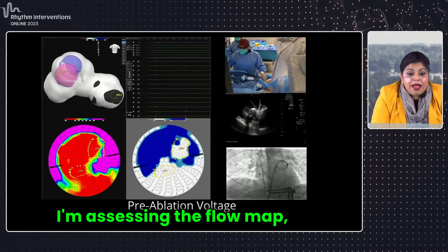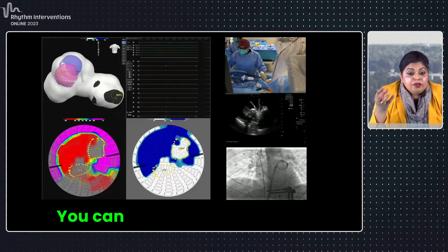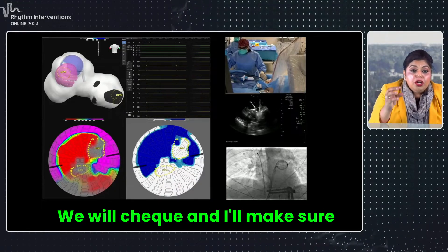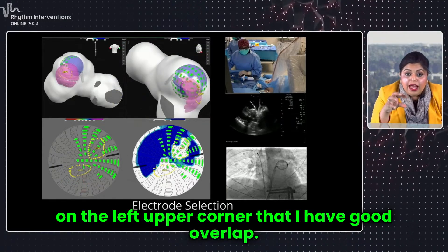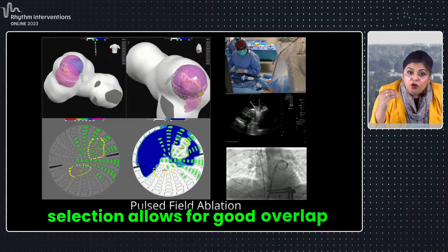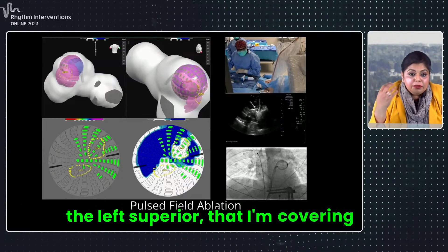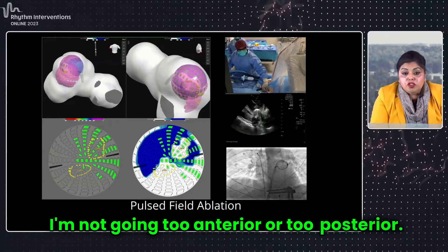I'm assessing the flow map, which is the green, and then we assess the contact map. You can see the left superior pulmonary vein there. I'll make sure on my 3D map in the left upper corner that I have good overlap. I'm looking on my globe to make sure my electrode selection allows for good overlap between the left inferior and the left superior, that I'm covering the carina, and that I'm not going too anterior or too posterior.